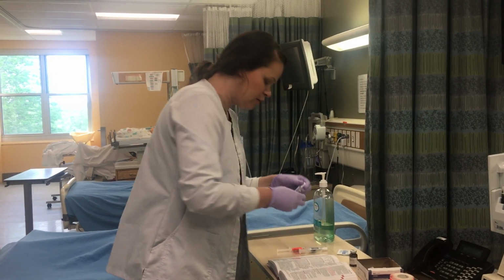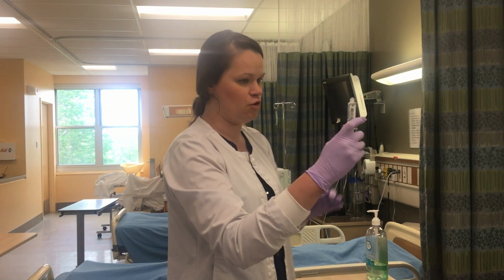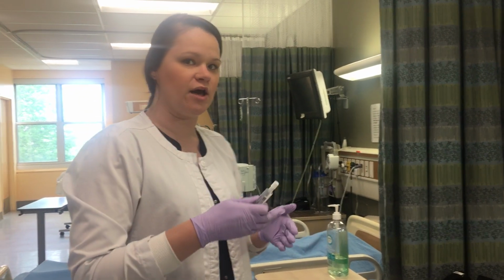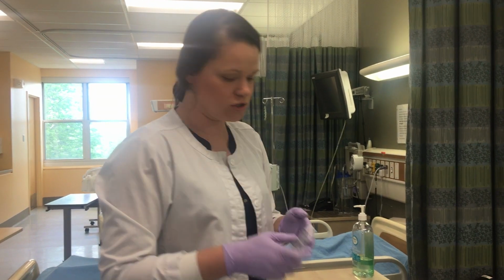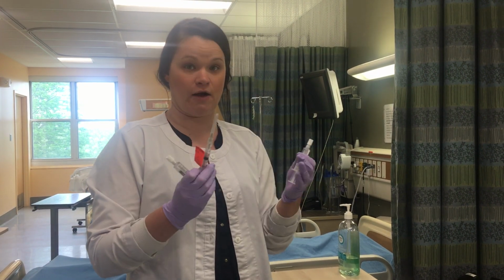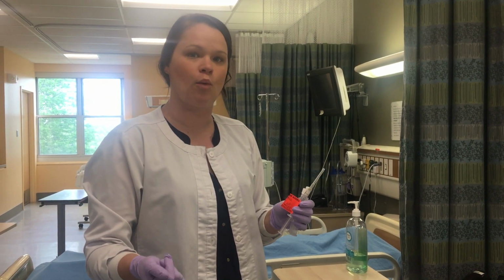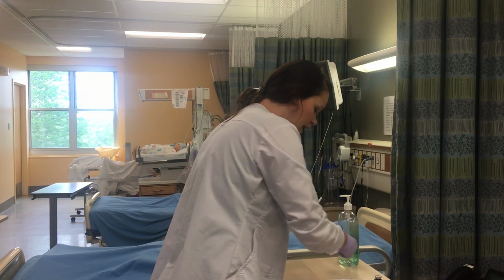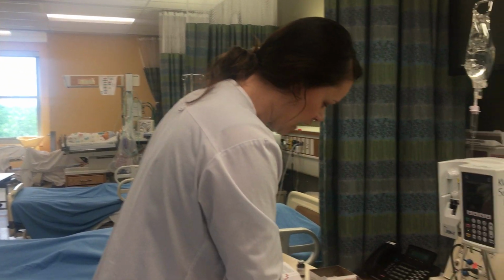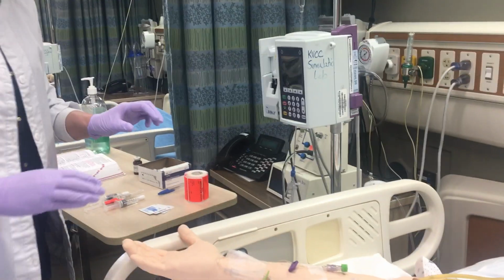Supplies that we will need: an IV flush of normal saline before, and you can see that I'm going to get the air bubble out. For peripheral IV flushing, we're going to give 2 to 3 milliliters. And I have my medication, and I have an IV flush for thereafter. So it's important you have all of your supplies ready and prepared when you're going to give an IV bolus medication. I also have plenty of alcohol swabs as well. So we'll come to the patient here. I've done all of my 6 rights. I have verified that this patient does not have an allergy.